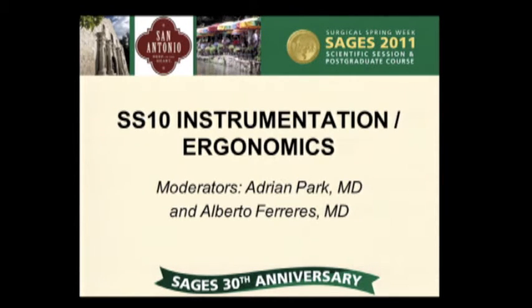Ronnie Clements, Nashville, Tennessee. Congratulations on a well-conducted study. I admire your looking into this idea. I will have one question about your methodology I'd like you to consider. You looked at the FLS task. That test was designed for a straight instrument, so you may have a self-predicting outcome that the straight laparoscopic instruments did indeed show better training improvement with that. I would ask, have you thought about a different task to perform that would really maximize the effect of an articulated instrument? Have you considered that as a possible variable here?